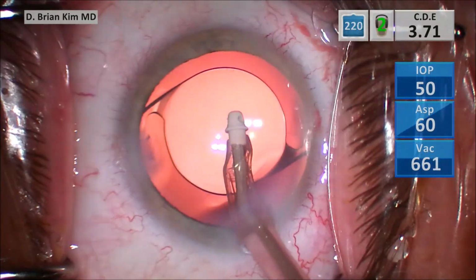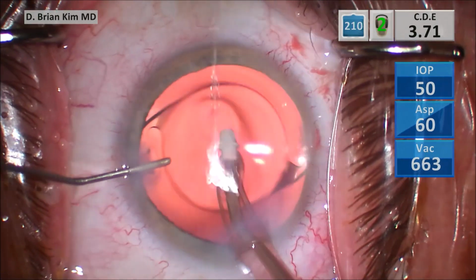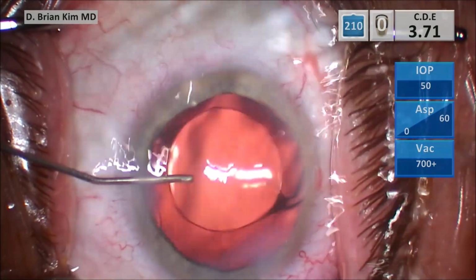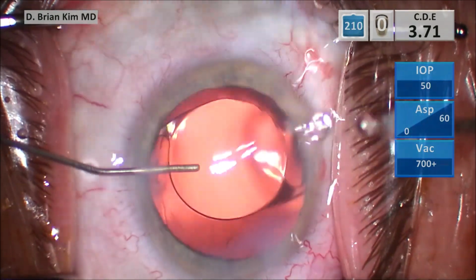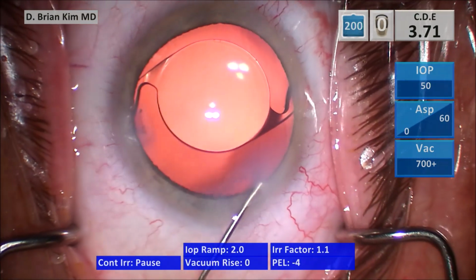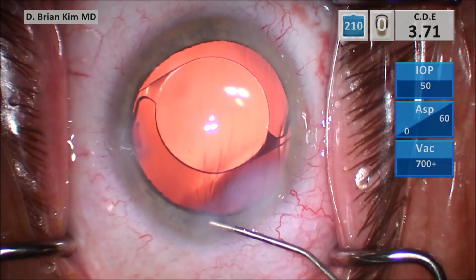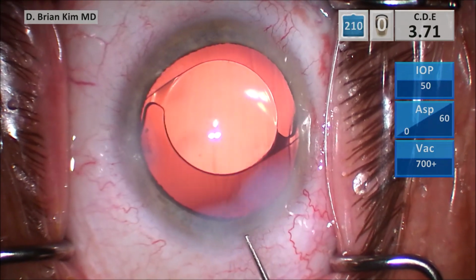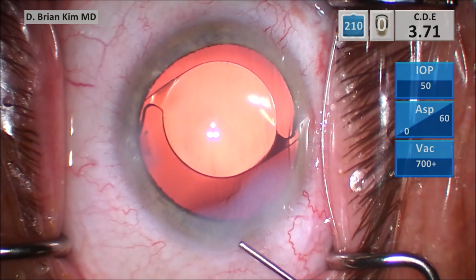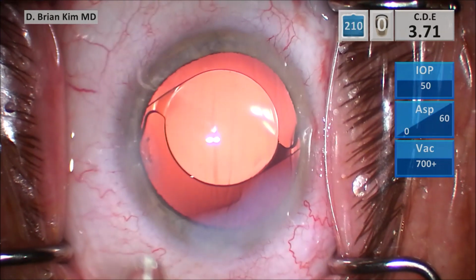That's why it's called double chop, not just the chopper, but the phaco tip. So you're redefining the use of the phaco tip and not utilizing it in the traditional way. And that's part of the problem. People have a mental block and they think, okay, the phaco tip is supposed to be used for vacuum and ultrasonic energy. Well, not necessarily. You can leverage just using mechanical forces, because now you can place that phaco tip deep in the bag safely and confidently, because you're not using those things. You're not using vacuum to suck and accidentally grab something, or using ultrasonic energy and accidentally break something.